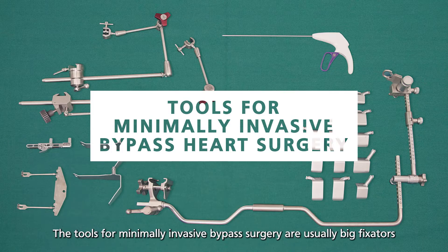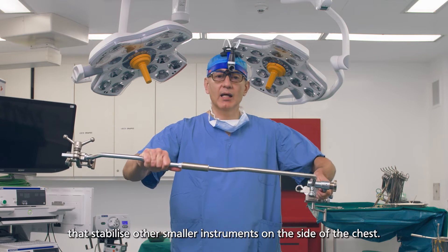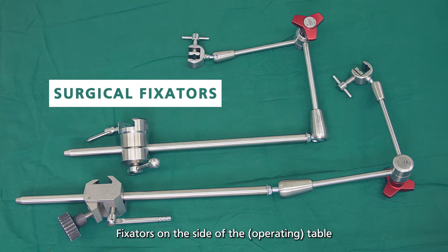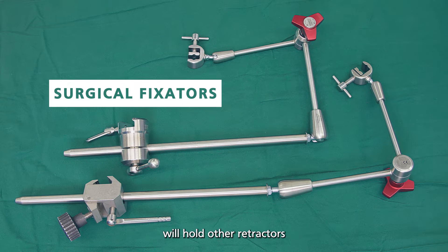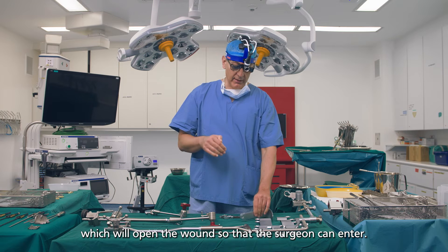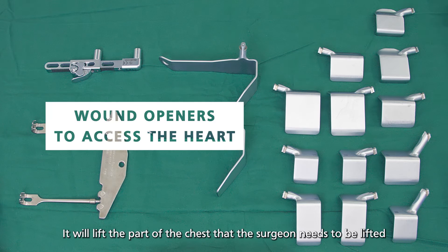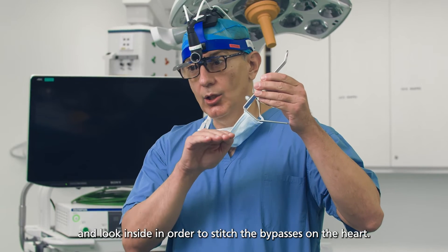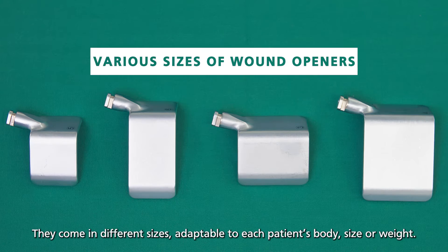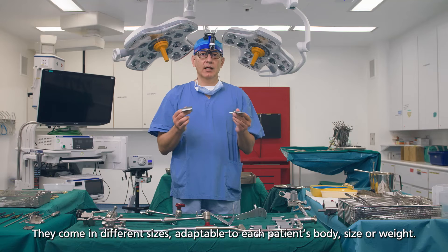The tools for minimal invasive bypass surgery are usually big fixators that stabilize other smaller instruments on the side of the chest. Fixators on the side of the table will hold other retractors which will open the wound so that the surgeon can enter. This is, for example, a wound opener — it will lift the part of the chest that the surgeon needs to be lifted and look inside in order to stitch the bypasses on the heart.